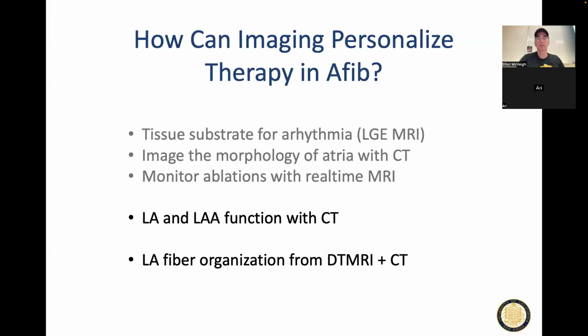Okay. So that's cardiac function. My feeling is that when I compare MR cardiac function, echo, and heavens, nuclear medicine cardiac function, remember what it looked like? It looked like a blurry donut that was just sort of going like this, right? You don't really have any details about what's going on there. But with CT, you can draw a very precise line around a region that has low function, right? So for me, it's the go-to technique if you're going to do cardiac function. The other thing is you get all of your data in one heartbeat. In MR, as we'll see, it takes 16 heartbeats to get a good movie, something like that. So this is way more robust. I just need one beat, right, to get it.